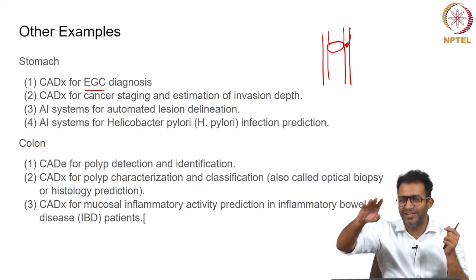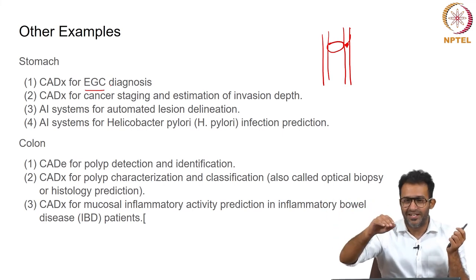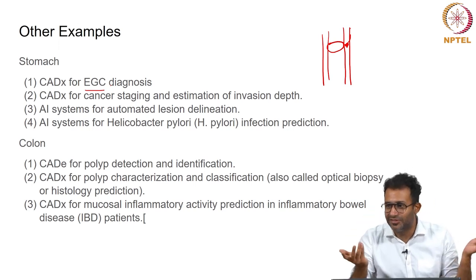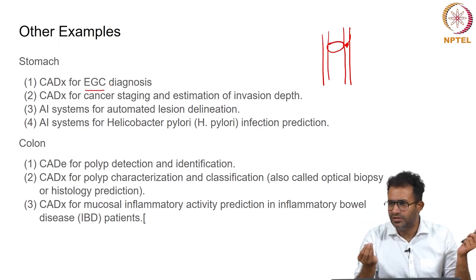The surgeon identifies the gastric cancer, takes a biopsy, confirms it. 3-4 days later, you go in, same endoscopy, you go in the morning, come back in the evening, your cancer is cured. And that's so beautiful.